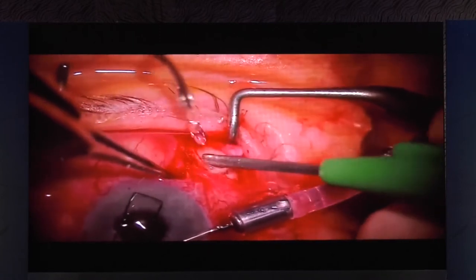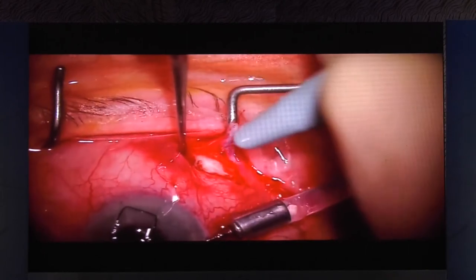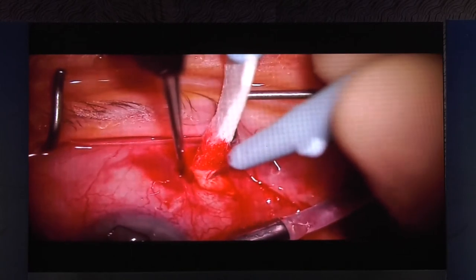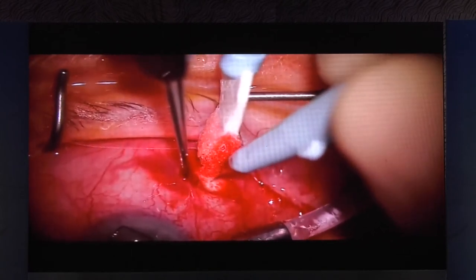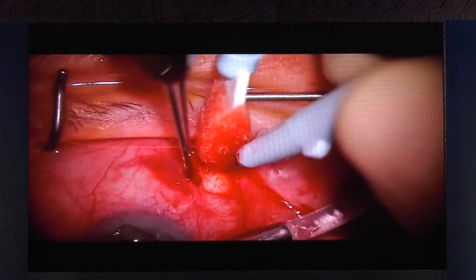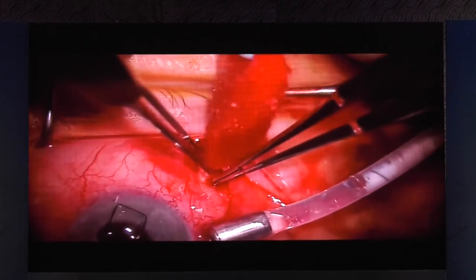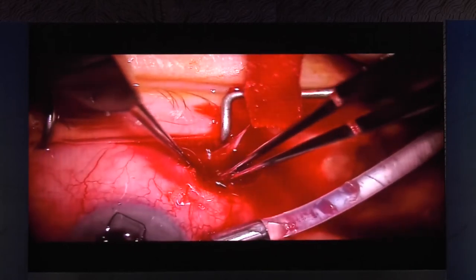and then create a radial incision, which you'll notice. Using a blade gingerly until I see some serous fluid. You diathermize first so that you get a better view. Once I see yellow fluid, I stop. Then I use 2 tooth forceps to open up the wound. And then you will see some serous fluid, and you will see some suprachoroidal hemorrhage, deep red blood coming out soon. Watch this. See that?